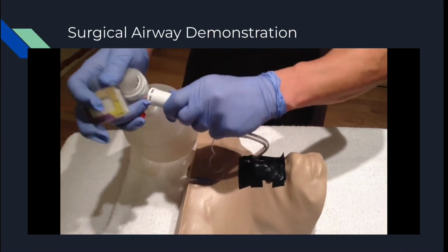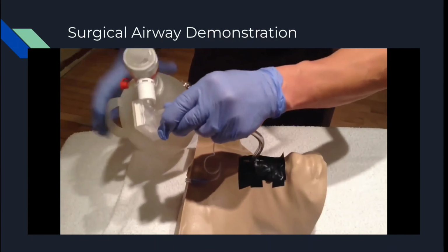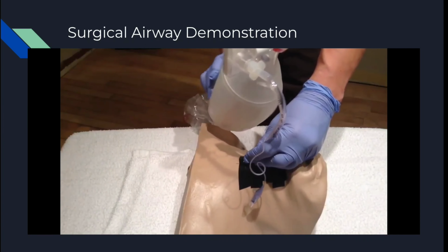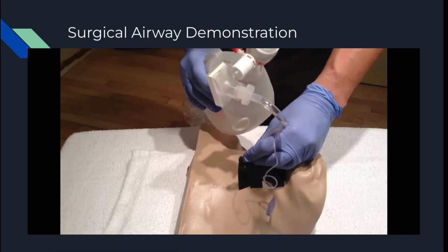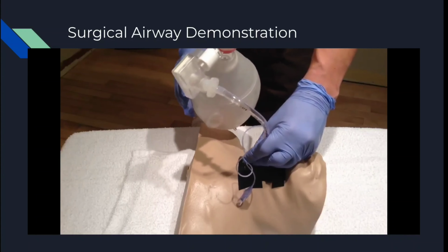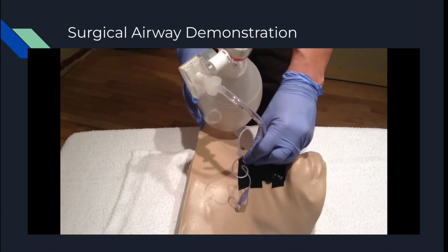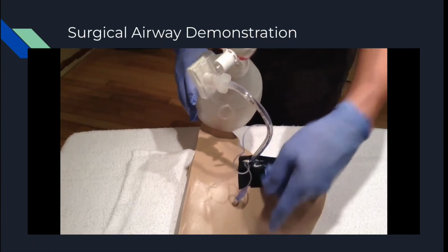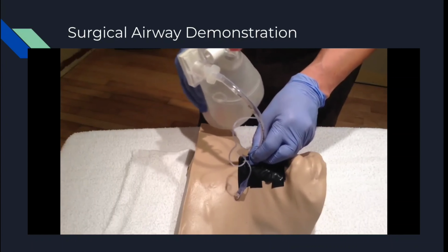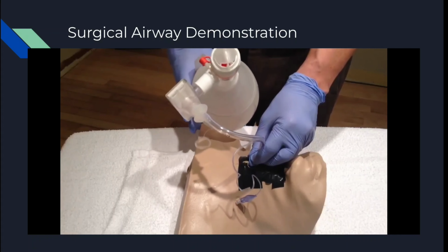Check a pulse there. How are we doing? How's our SAT doing there? Do another set of vitals, please. Listen to chest rise and fall. Got end tidal CO2. Make sure that probe is on properly, please. Thank you. Run another blood pressure, please. Still got good end tidal CO2. Okay, cuff is up. Got the tube secured, airway. Breathing, you got good air entry bilaterally. C, circulation, what's the blood pressure doing now?